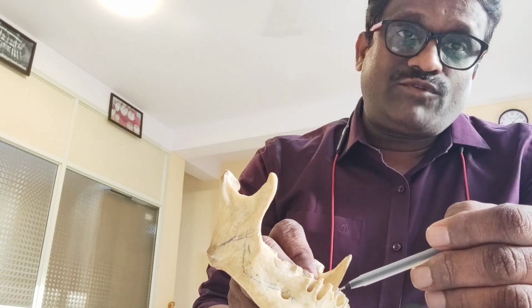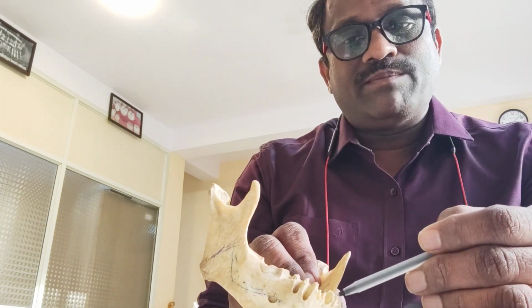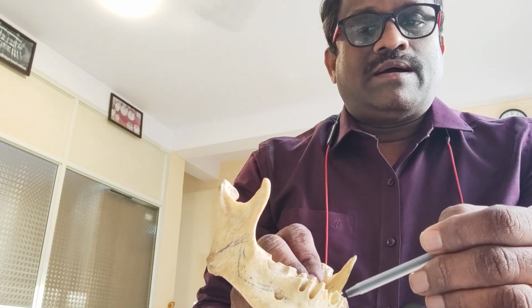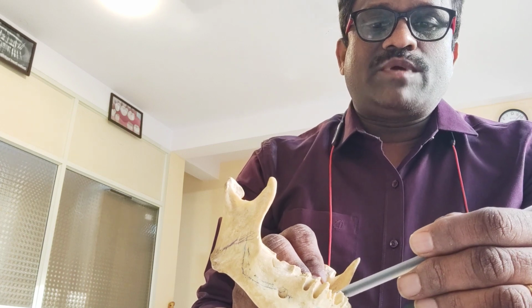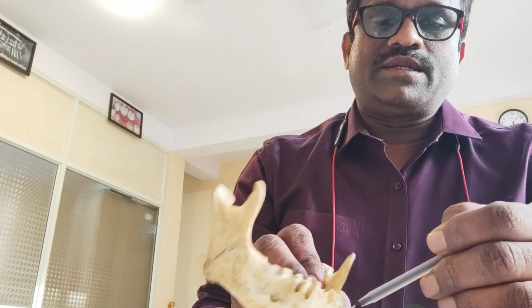So it is easy to bypass the nerve from the buccal to the lingual aspect in such cases.